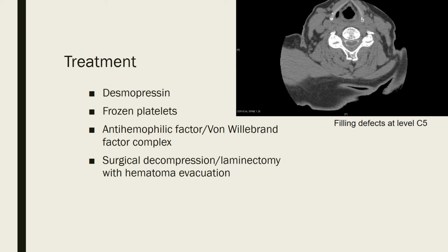She also underwent surgery for a decompression laminectomy, which was done to help create space within the spinal canal, which would allow for free movement of the cord and spinal nerves. They also removed the hematoma. And this is another image from her scan here.